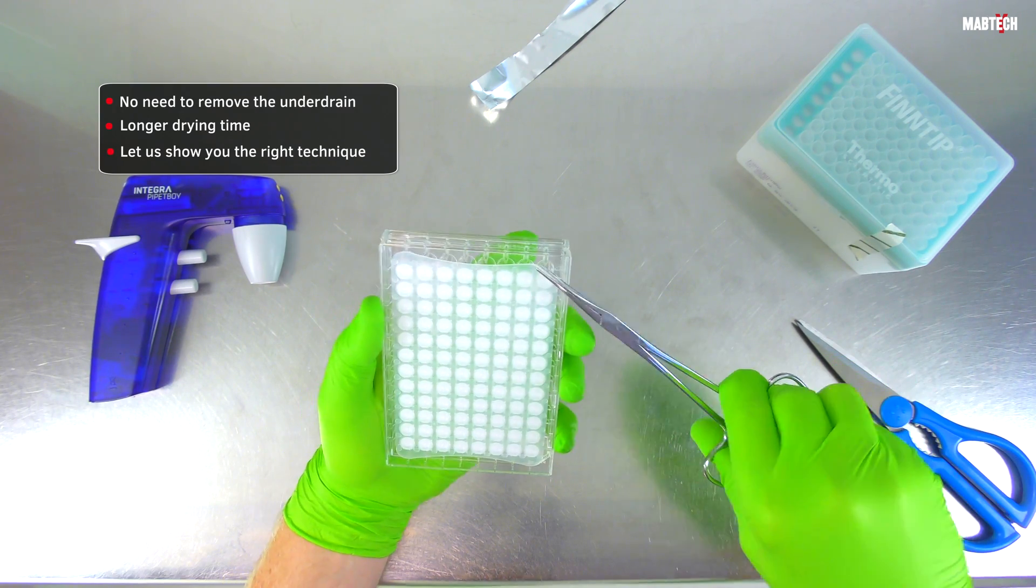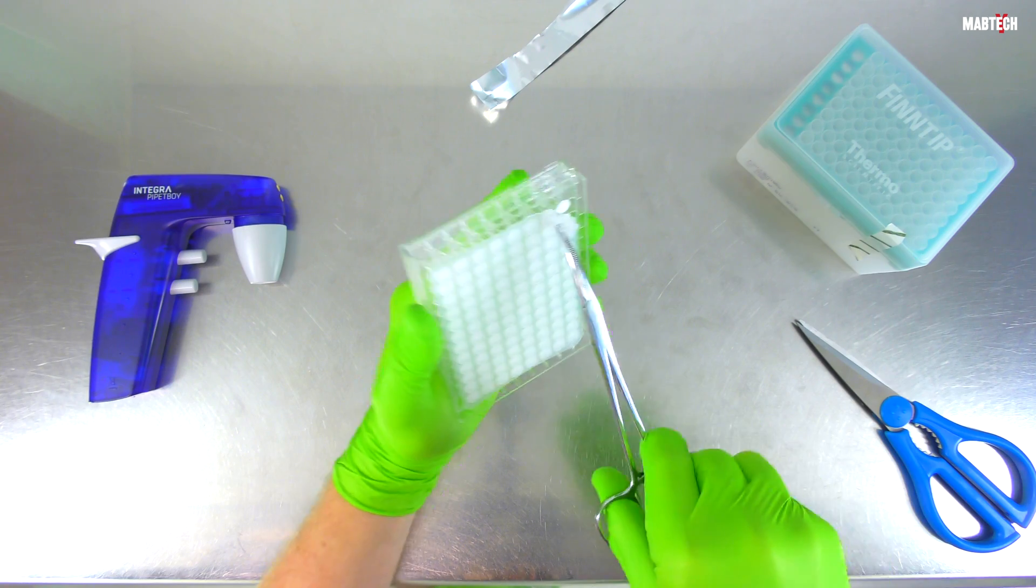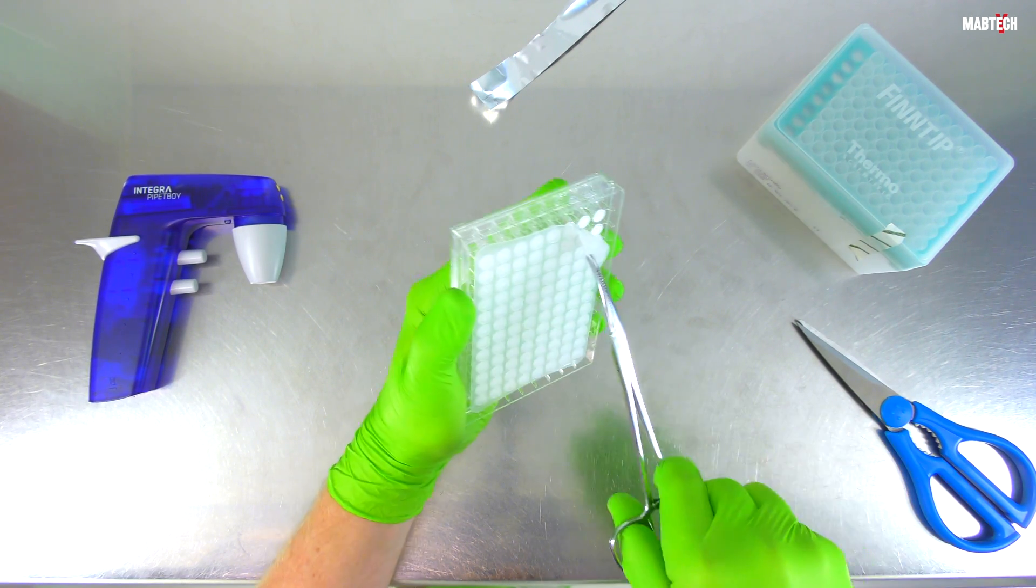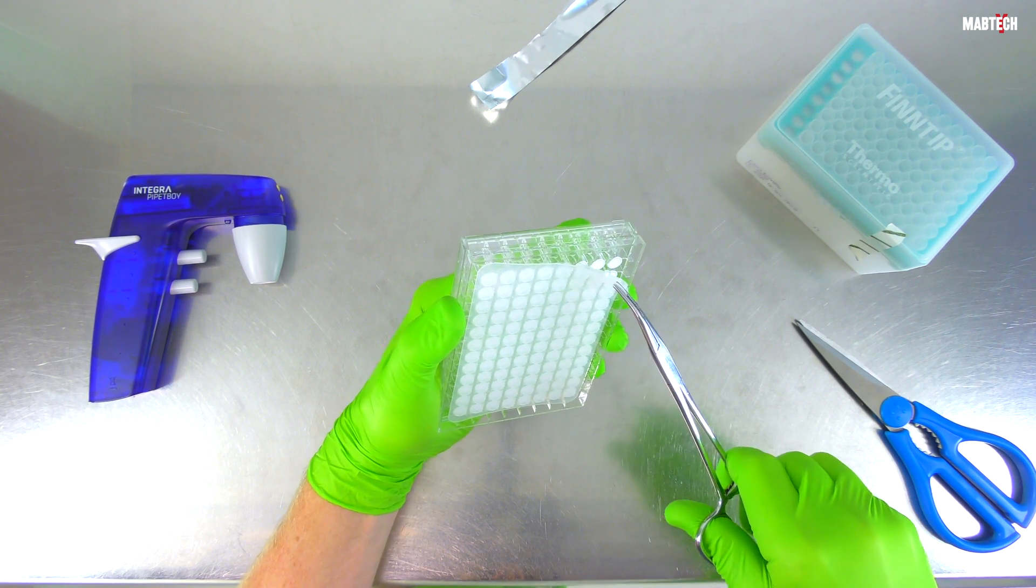Let us show you the right technique of how to do it using the pincer tool in the video. We begin by attacking one of the underdrain corners. Notice how the technician undoes the underdrain by using the wiggle technique.